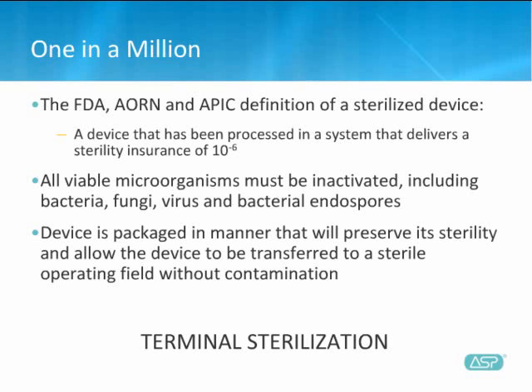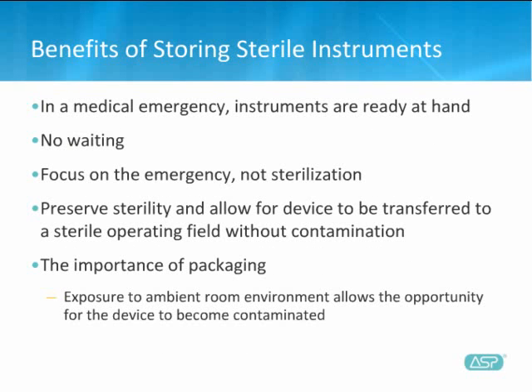As mentioned earlier, to maintain sterility, the device must be packaged, which allows it to be transferred to a sterile operating field or to be used at a later time. Don't underestimate the value of storing sterile instruments. In addition to being able to move the instruments to an operating field without contamination, in an emergency, the instruments are ready when you need them, allowing healthcare professionals to focus on the medical emergency at hand.